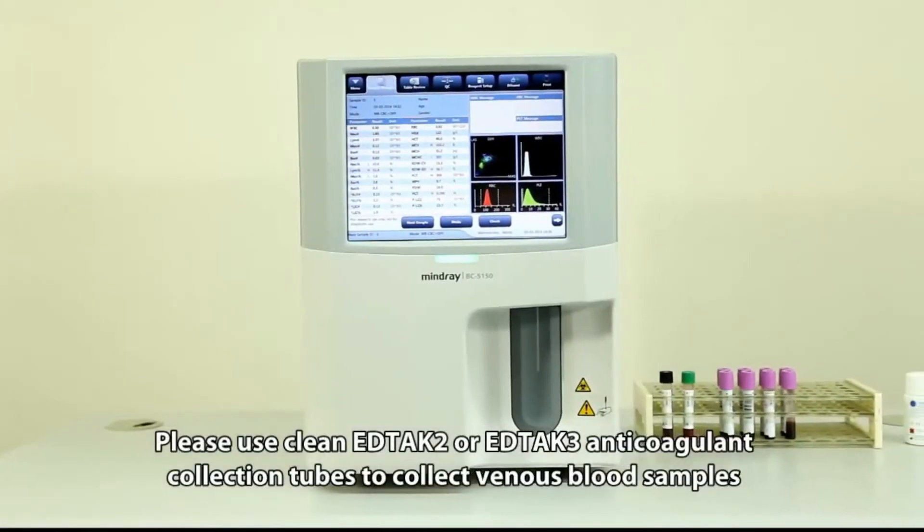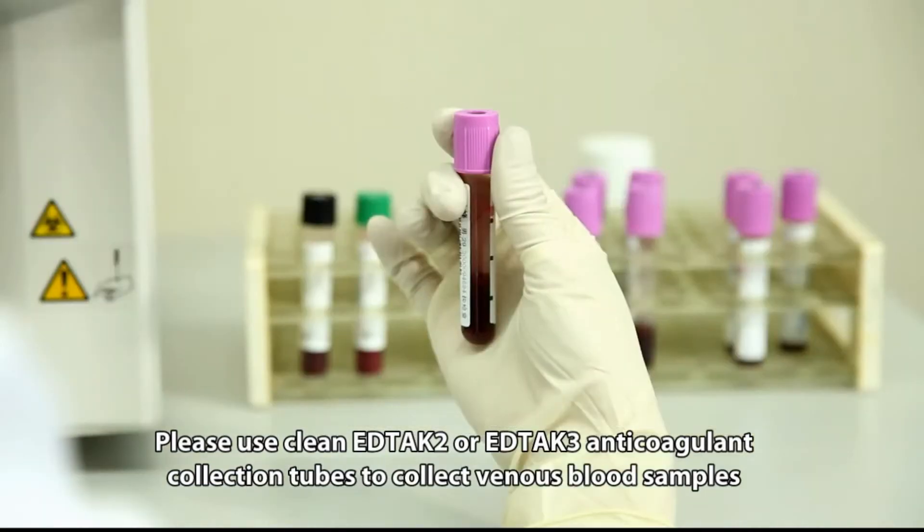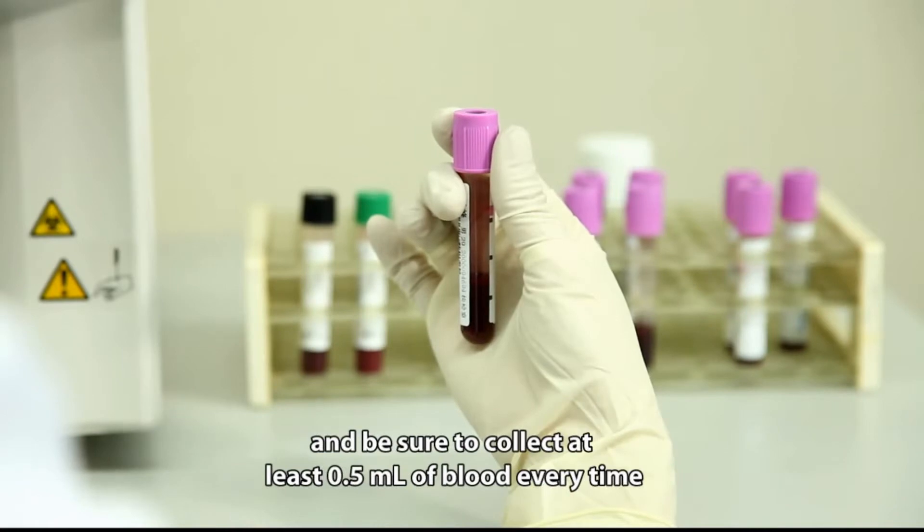Please use clean EDTA-K2 or EDTA-K3 anticoagulant collection tubes to collect venous blood samples, and be sure to collect at least 0.5 milliliters of blood each time.